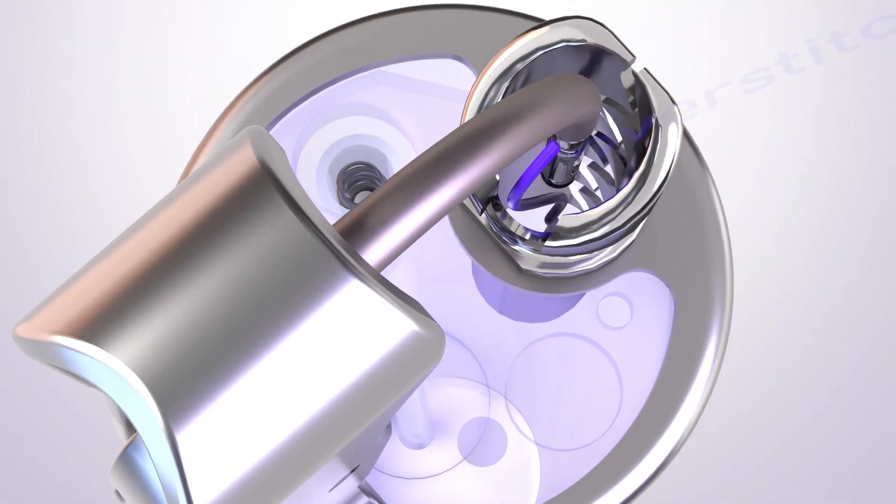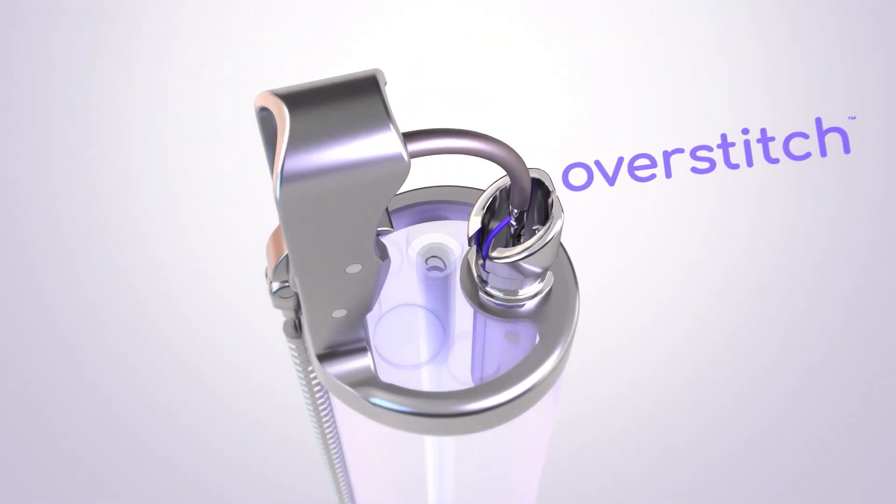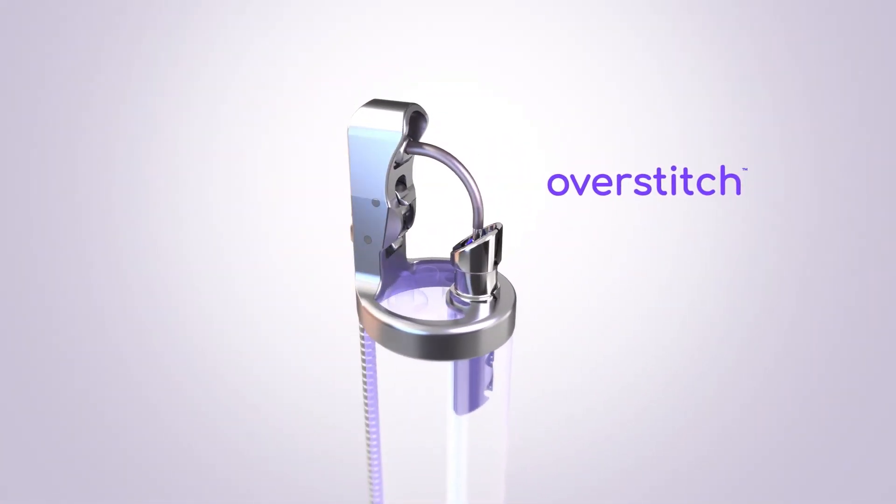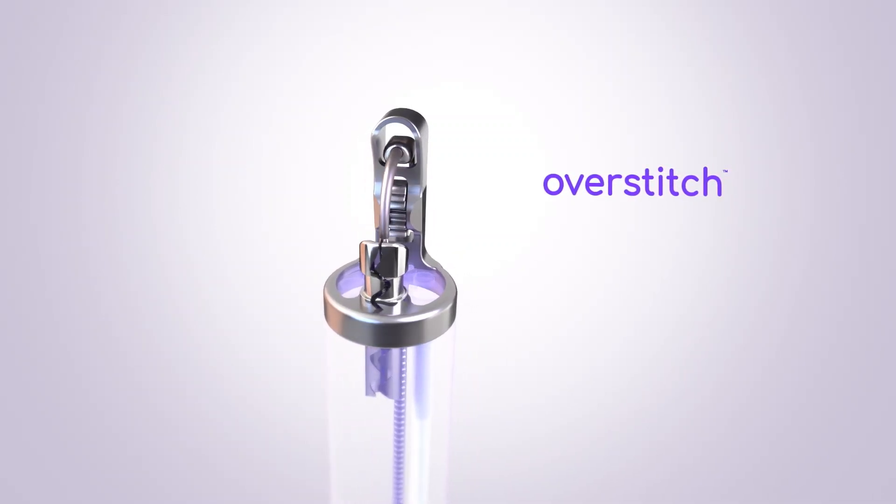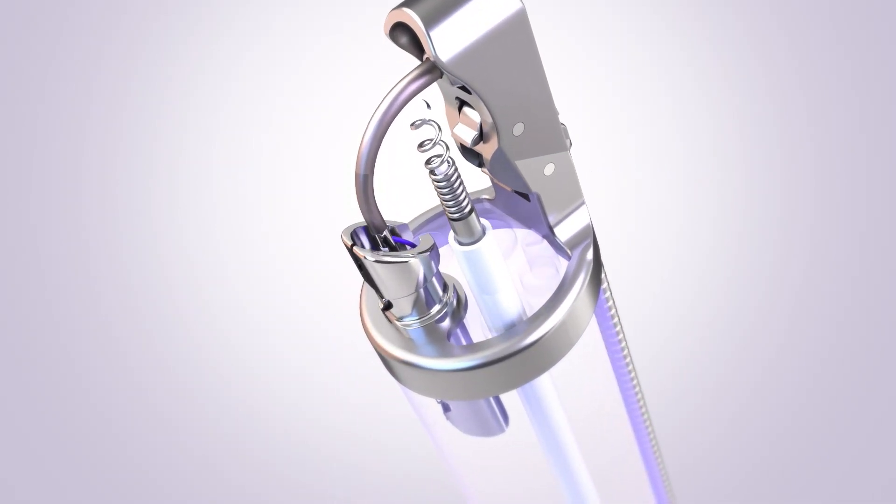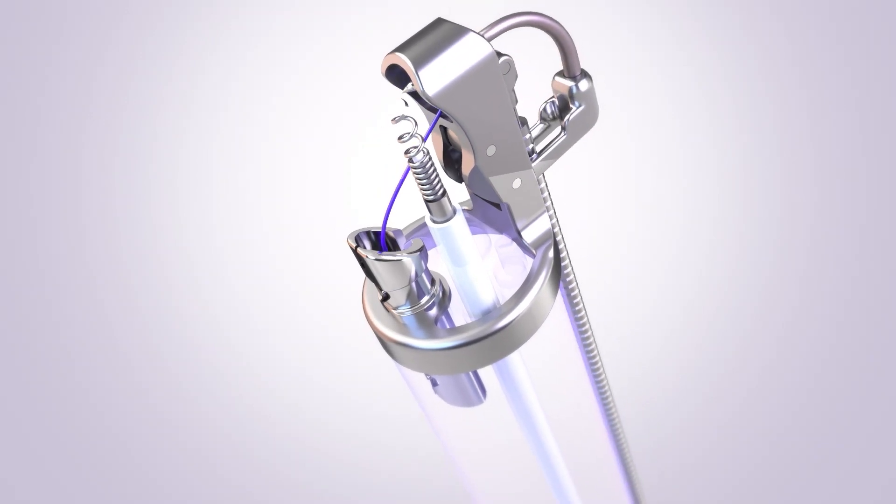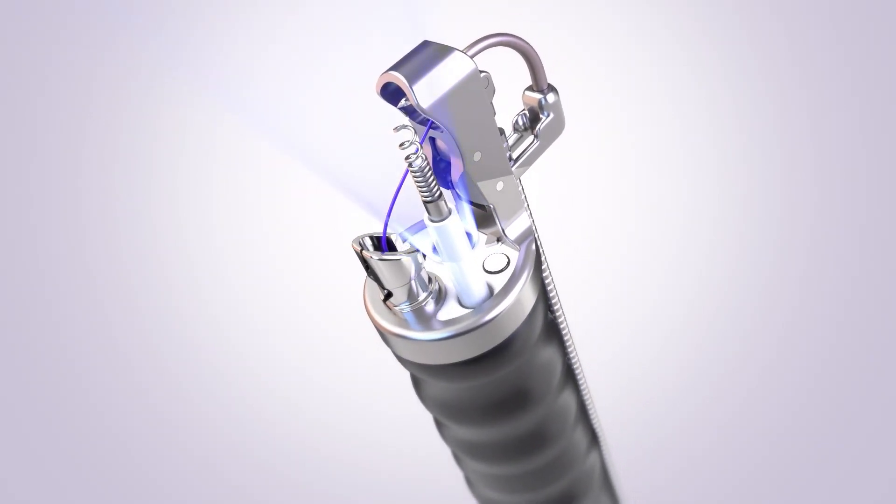ESG is performed using the Apollo Overstitch System, the device CE marked for this procedure. The Overstitch System is a small endoscopic suturing device about the size of your finger that attaches to the end of an endoscope or camera.